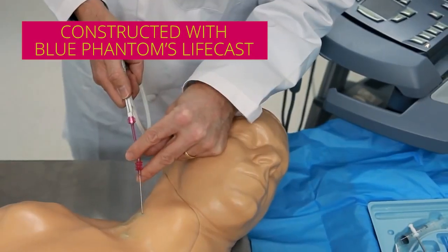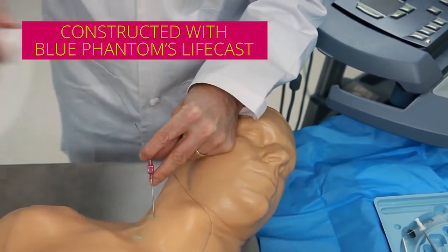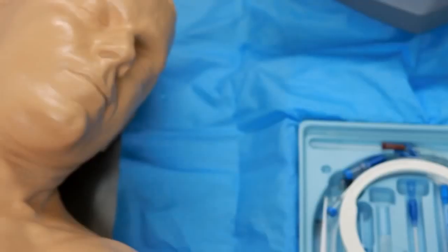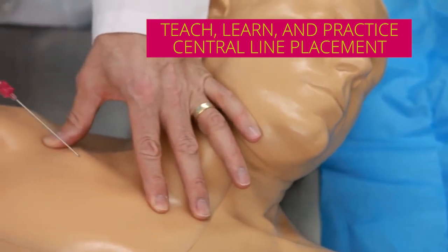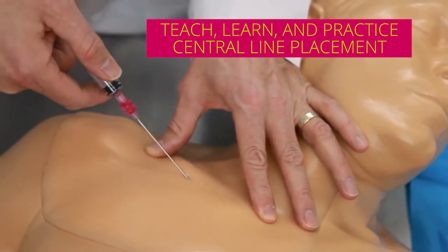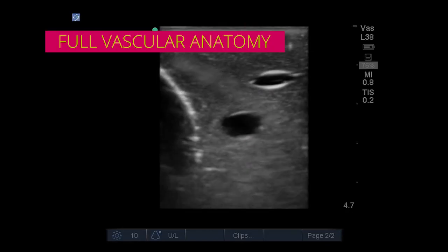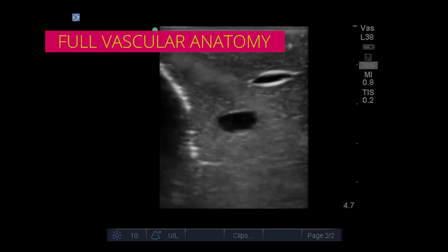Constructed with BluePhantom's LifeCast, this durable simulator incorporates all the necessary anatomy to teach, learn, and practice the skills associated with central line placement. This trainer shows the upper thorax to the neck and has full vascular anatomy, including the internal jugular vein and carotid artery.